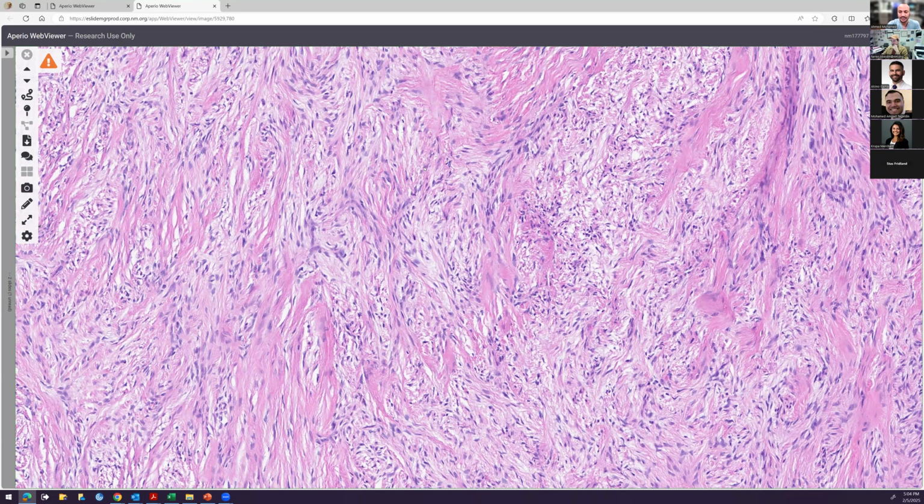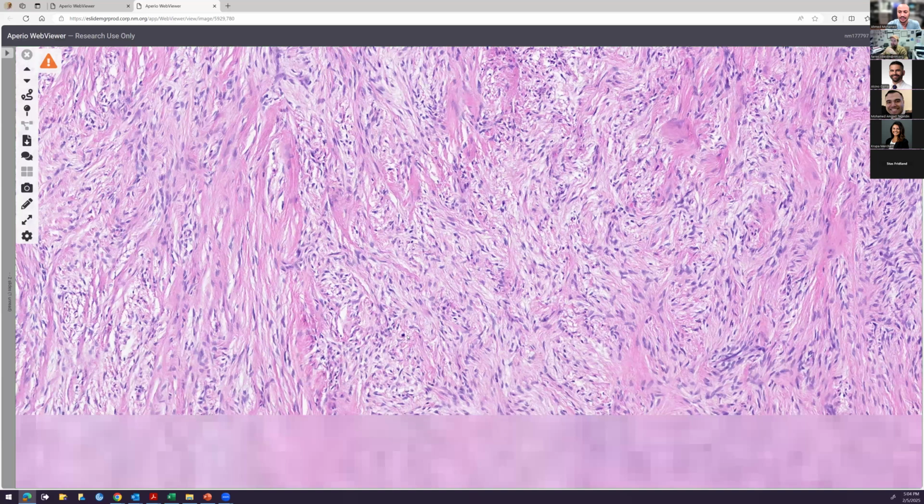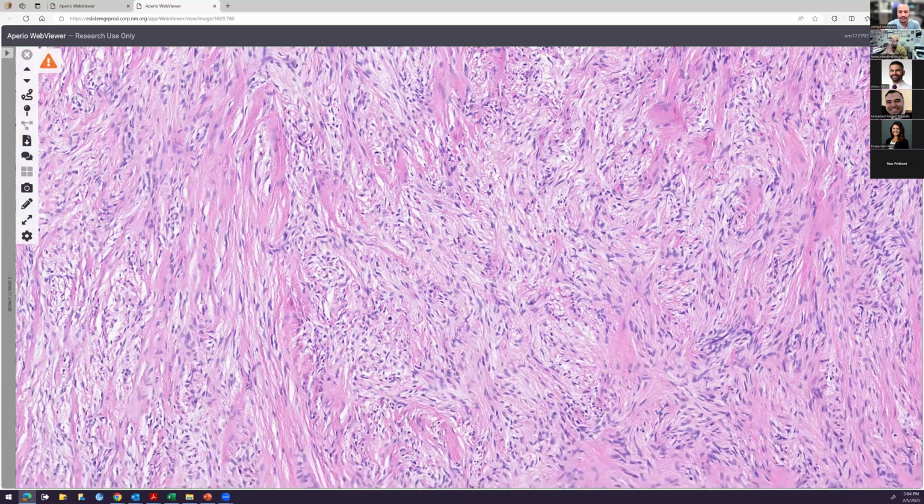The other thought that I had was a low-grade fibromyxoid sarcoma. Low-grade fibromyxoid sarcoma. Okay, all right. So how are you making that diagnosis? On histology, we have these myxoid areas intermixed with more fibrotic, collagenized areas. Cellularity is, as described, bland, like this one. We have some curvilinear vessels going back and forth. So overall I would maybe do a differential and molecular testing.